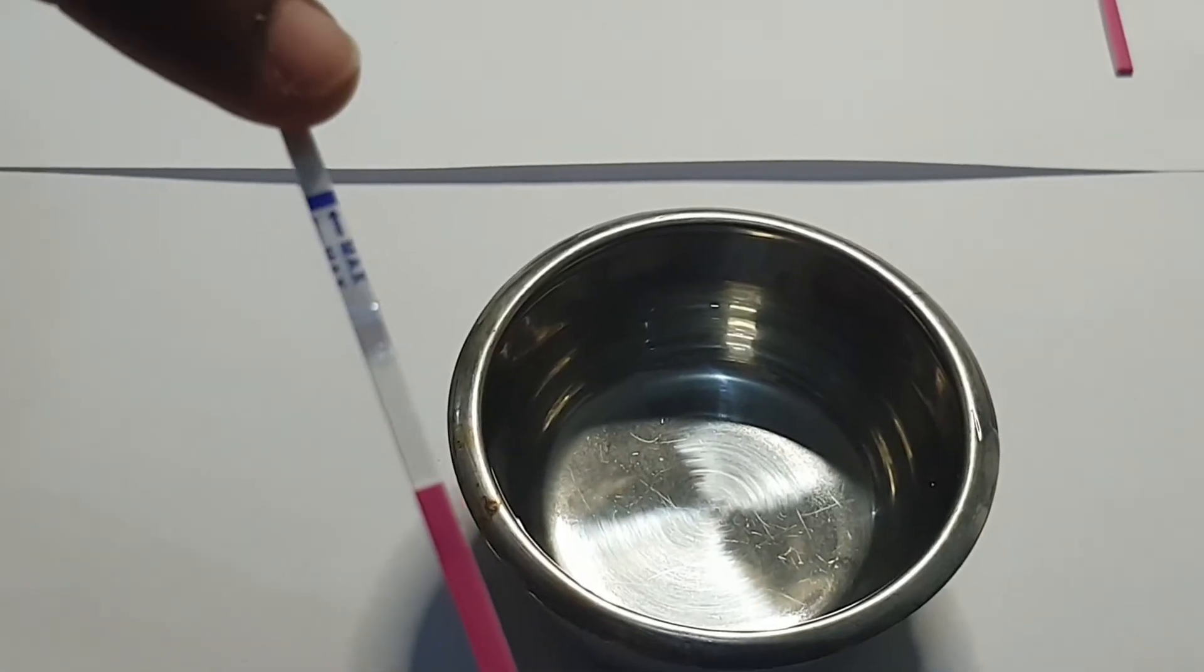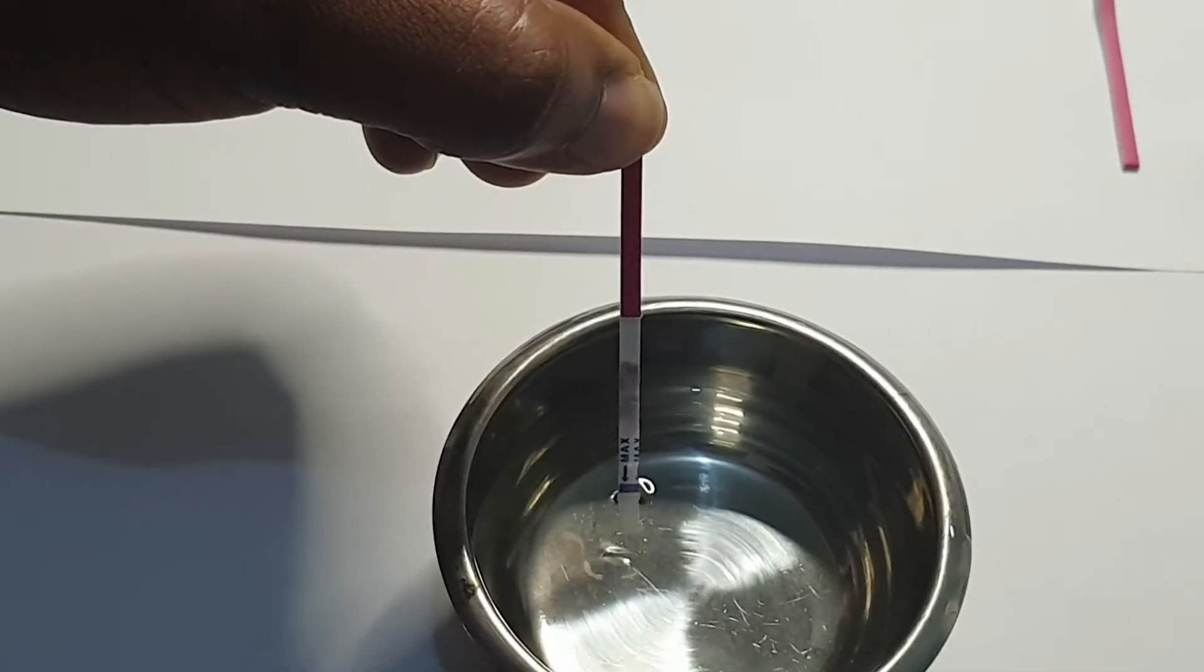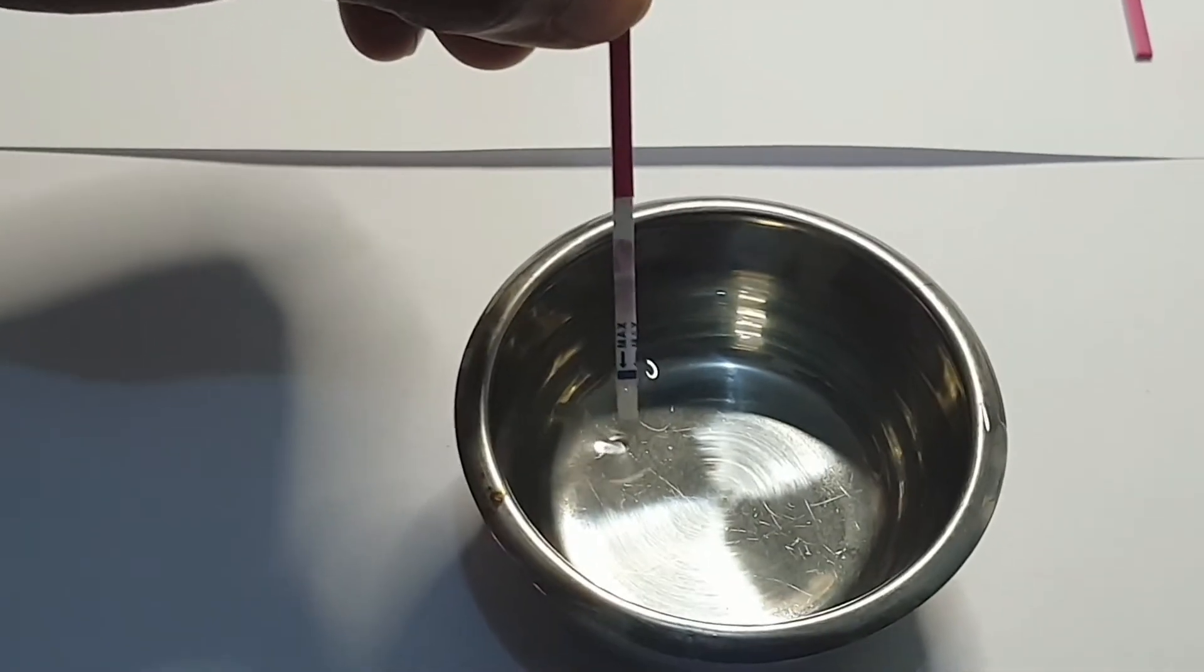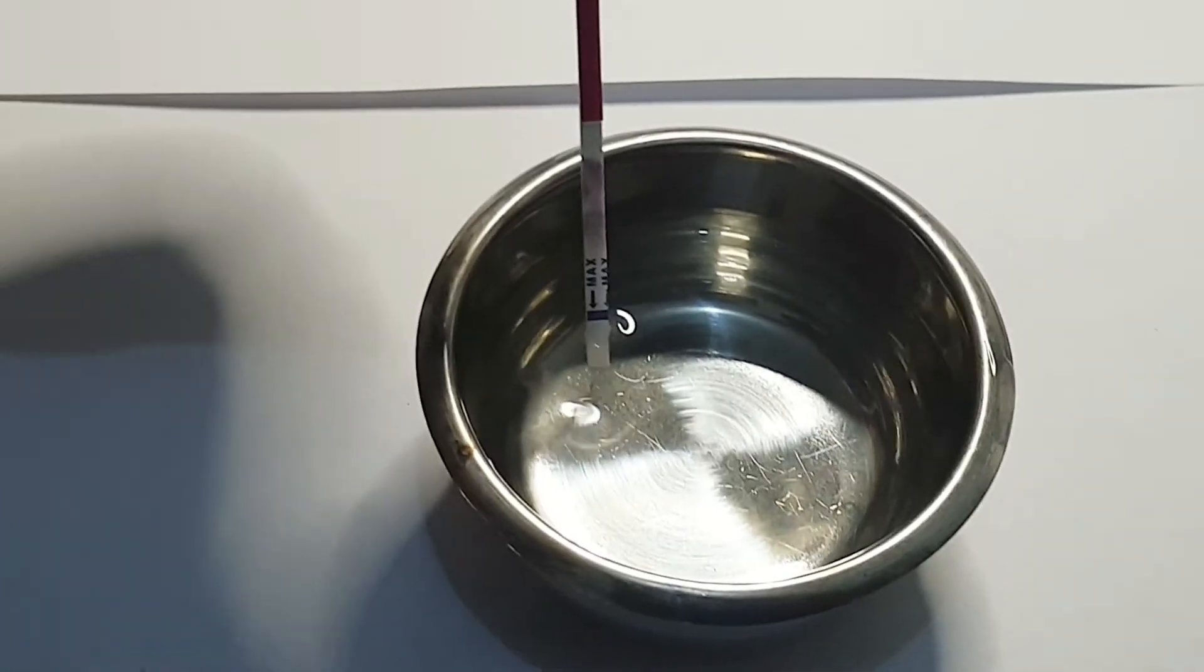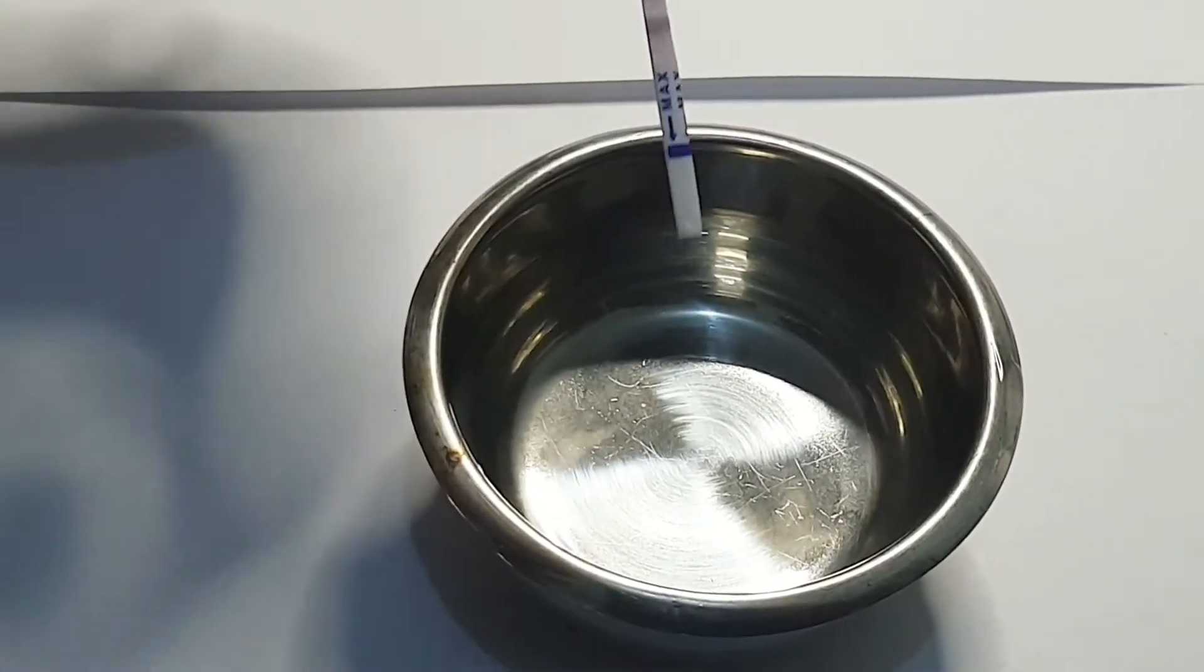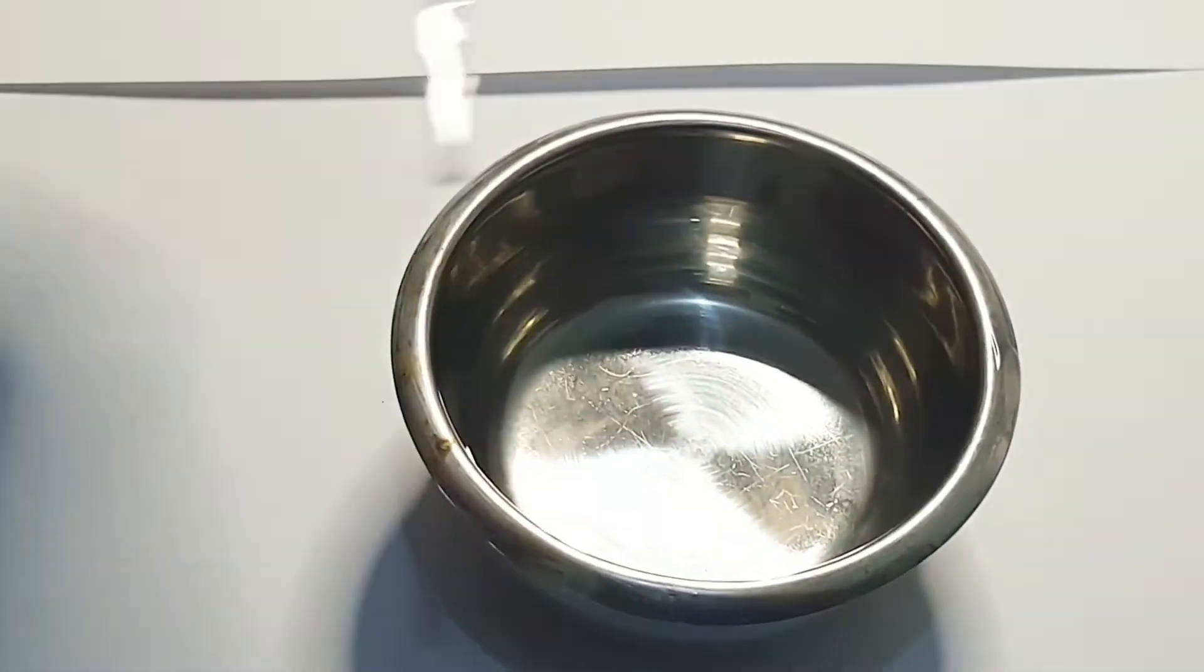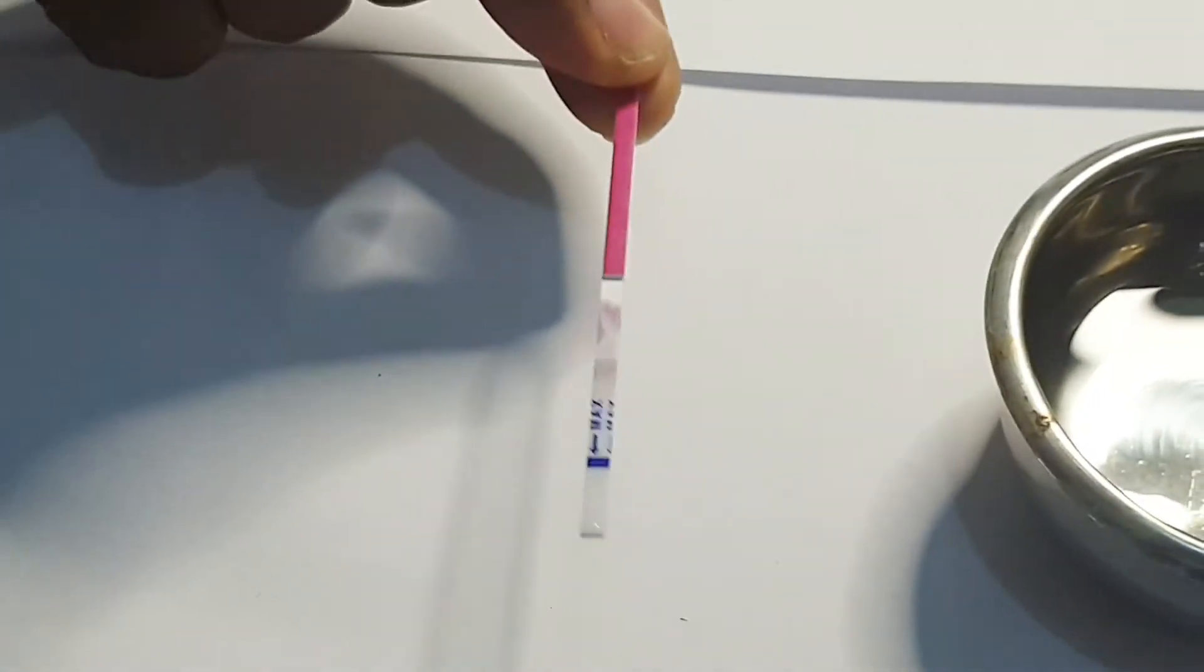Next, you look out for this max line on the strip. When you dip in your urine, you make sure it doesn't exceed this line. Then you wait for 3 seconds and then lay it flat on a dry surface to read the results 10 minutes later.